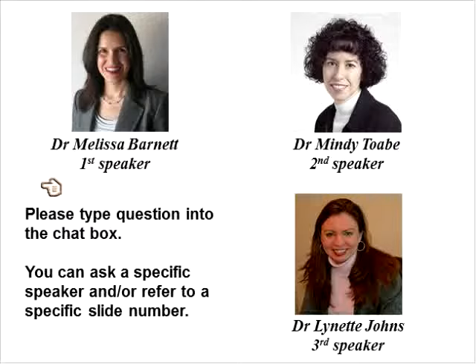We use just whatever the patient prefers. The severe dry eye patients tend to be very brand specific for themselves, and so we just recommend what they came in using prior to being fit with a scleral lens.